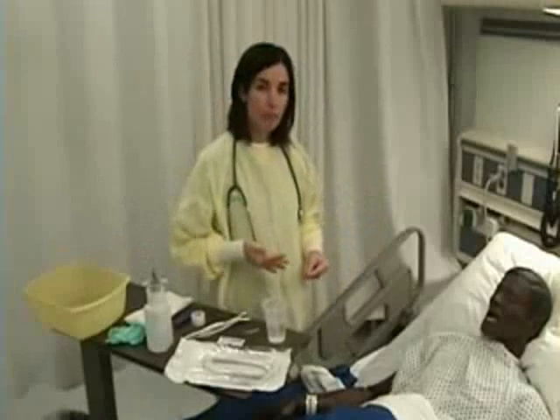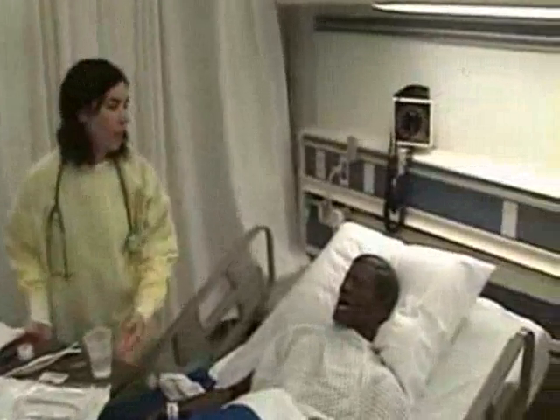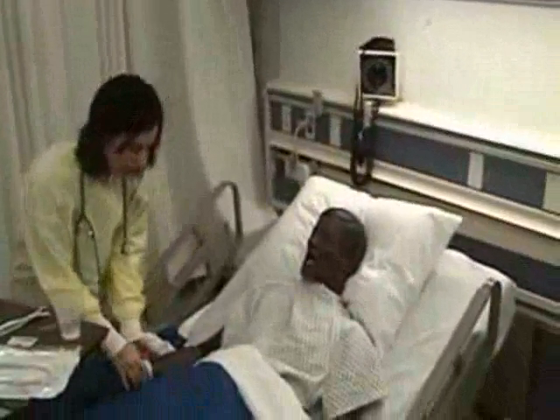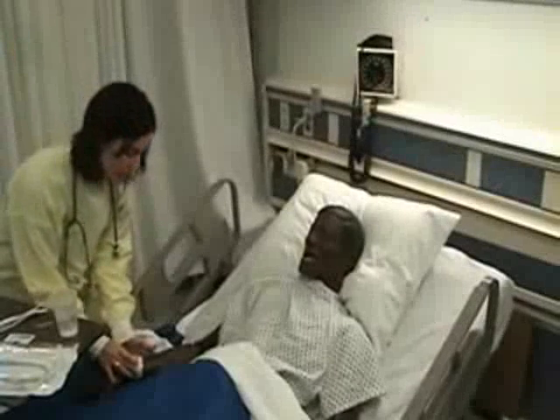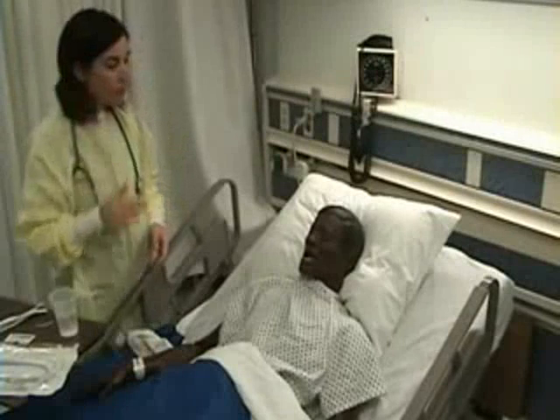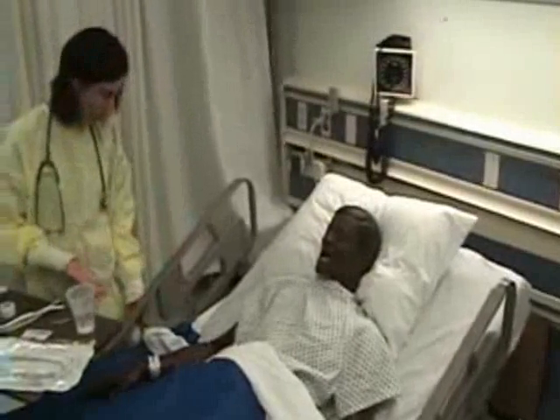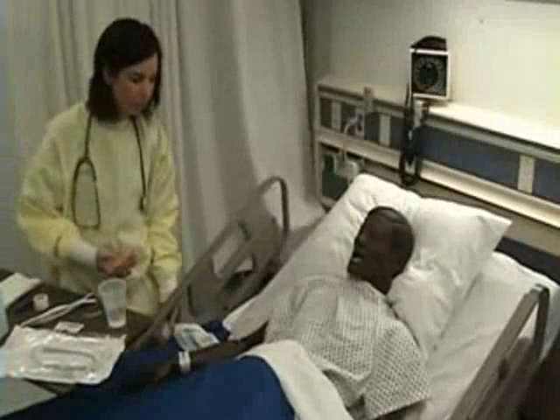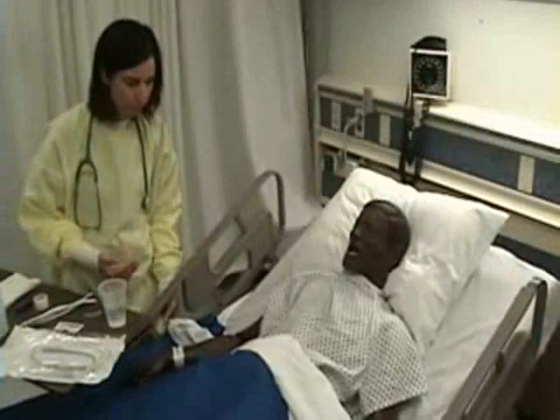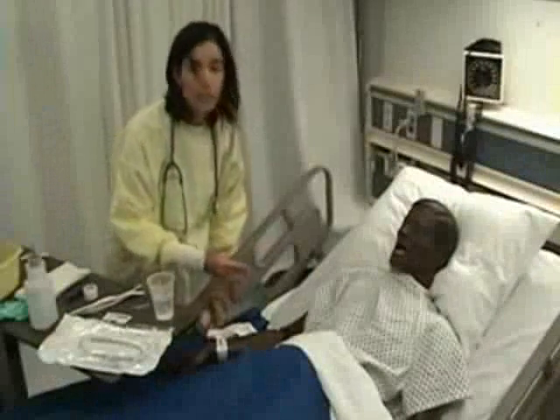I will begin by entering my patient's room, washing my hands, introducing myself. I will find my patient's identification bracelet and ask him to state his name and date of birth. Next, I'm going to talk to my patient and explain the procedure. I'm going to raise the bed to a position of comfort for myself for working. And I'm going to assist my patient in the bed to sit all the way in a high Fowler's position, 90 degrees.